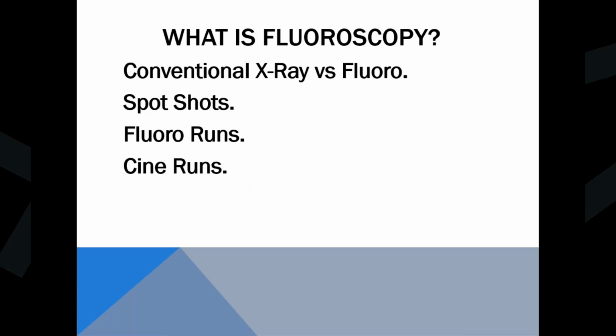One thing that is the same between them is that they make X-rays the same way. So if you have a fluoro system versus a conventional X-ray system, the X-ray production, the generator, all of that are identical. It's what they do with the X-ray and how they record it afterwards that sets the two apart.